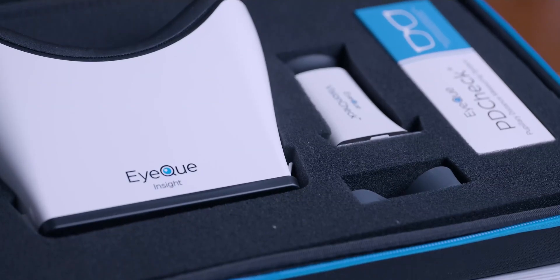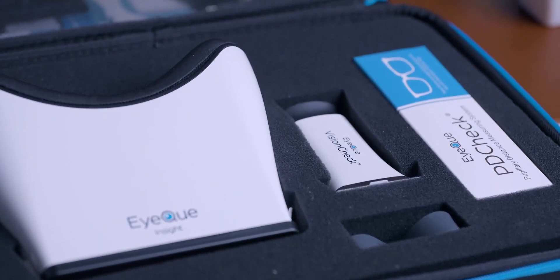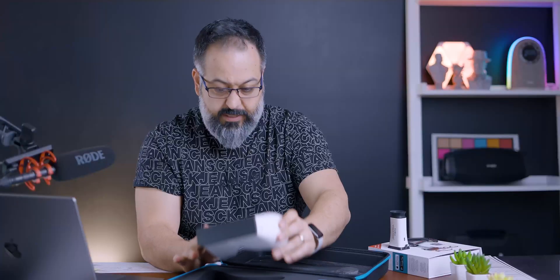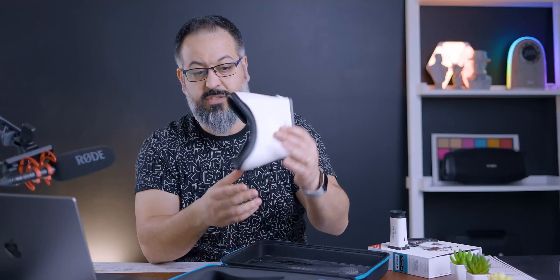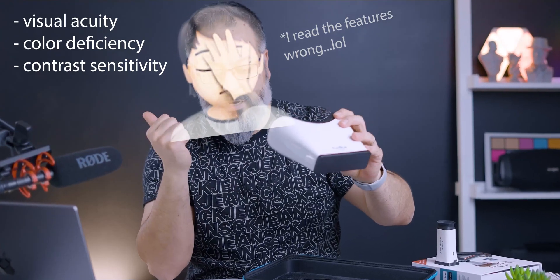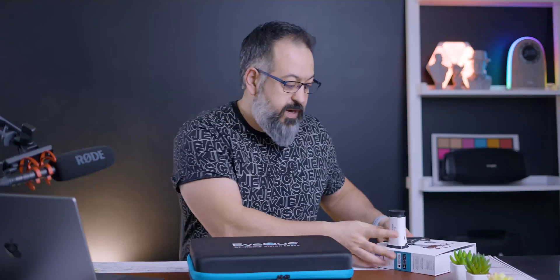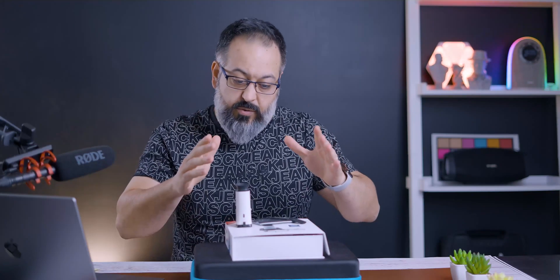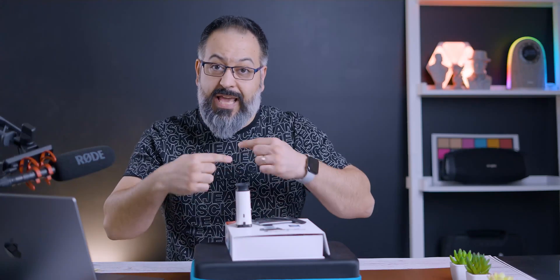You still get your Vision Check, your strap, your white frame for the PD check, and the additional device for the larger kit. Both devices, regardless of which one you get, come with a unique serial number that you have to use to activate the device. The good news is you can use it as many times as you want, so one device can serve your entire household — but each person needs to download the app.